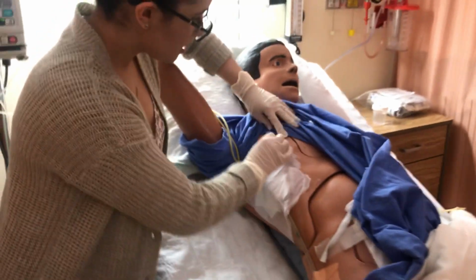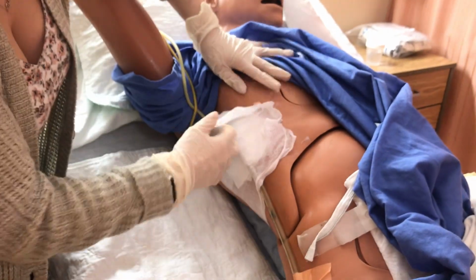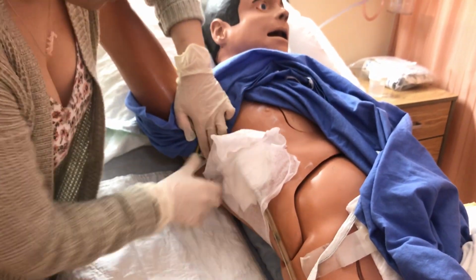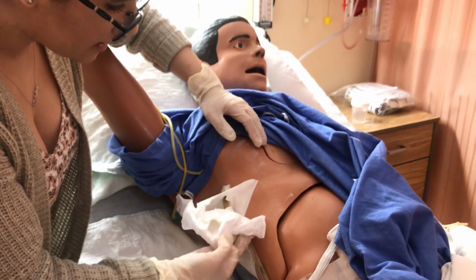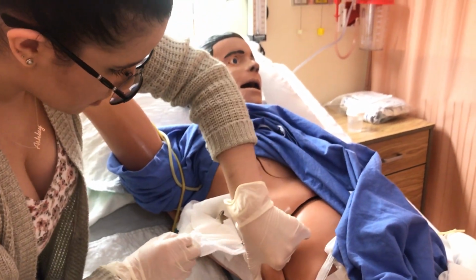So now in a patient, the chest tube would be stitched in, but because it is not stitched in, I'm just going to make sure I stabilize it while I'm taking out the old dressing.